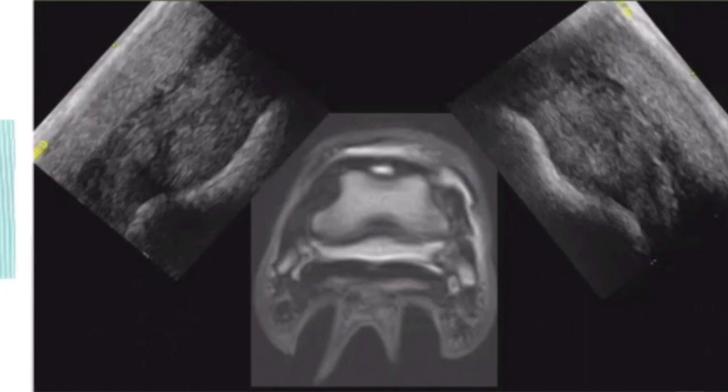So again, here's the one part we can see. Here's our abnormal ultrasound. If you can't do an MRI, which you just need to let your client know, hey, yeah, we saw that this is abnormal here in the proximal part of the ligament, but distal lesions are more common, and this could be a lot worse than we recognize just from our ultrasound. Okay, so let's keep moving up the leg and talk about the sesamoidean ligaments.